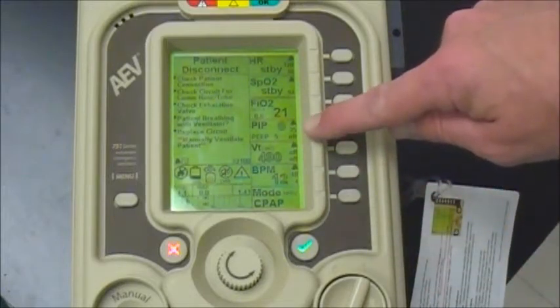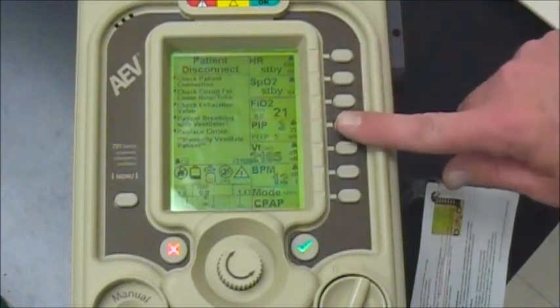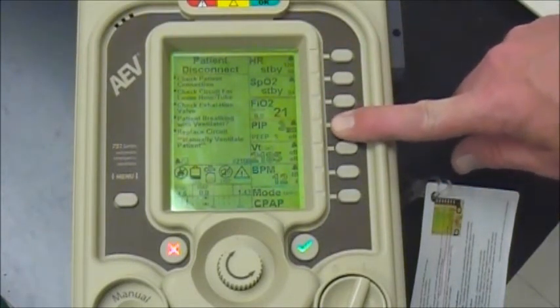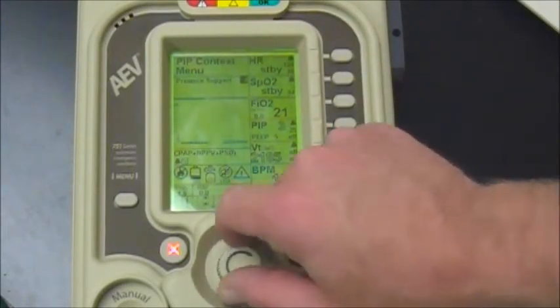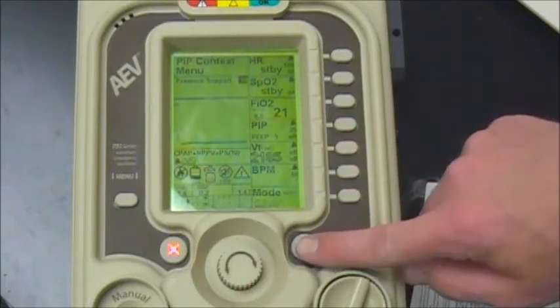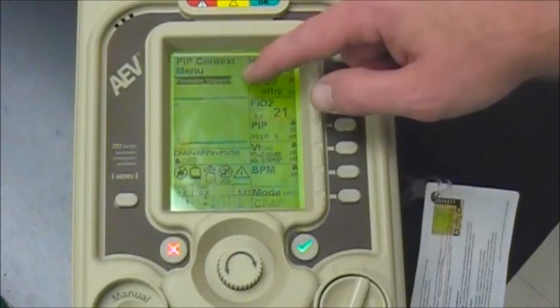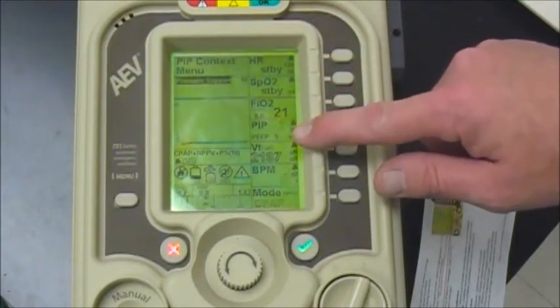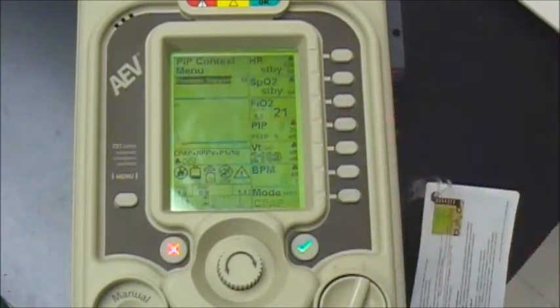We're going to have a PEEP default of 5 and leave that there to start. Next, push the button next to the PIP and hold it down to get the window that pops up with pressure support. The recommendation is to start at about 10, then accept that setting. Now we've got 10 over 5 — inspiratory pressure of 10 centimeters of water, and the patient breathes out against 5. That's where we want to start and see how they do.